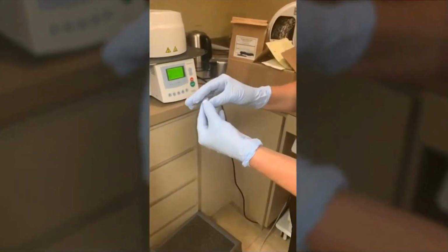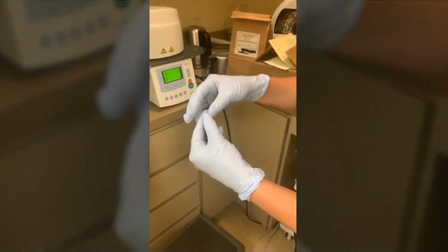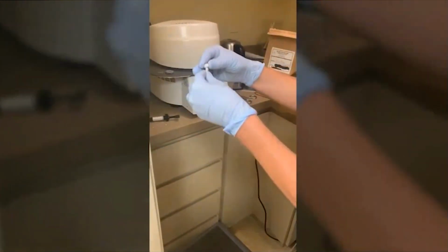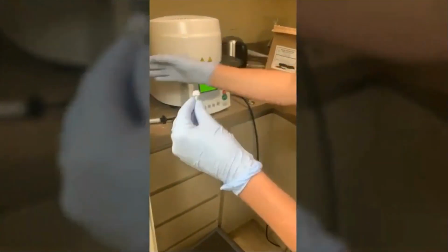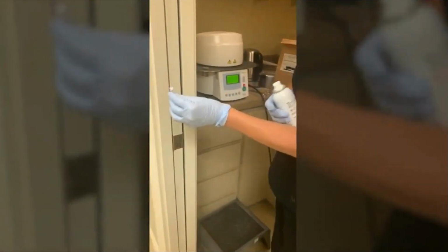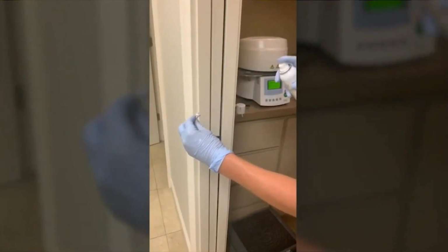So I'm putting a little putty on the inside of the tooth and covering the margins before I glaze. You never, ever want to get glaze inside your prep or on your margins, because then it won't seat properly. So you want to make sure that that is all covered. So now I'm holding it and I'm going to be spraying some glaze onto here.